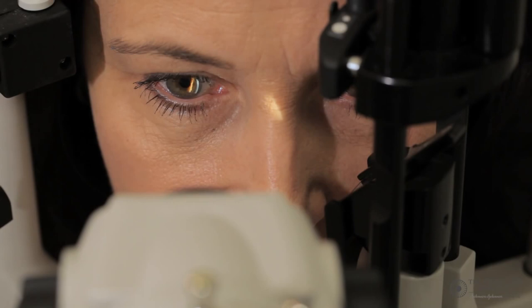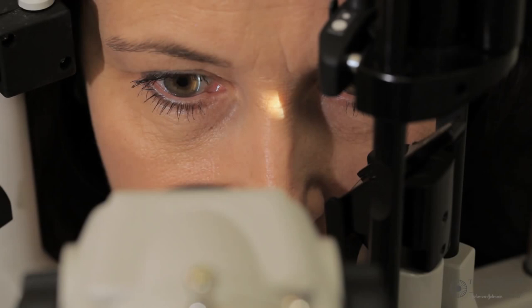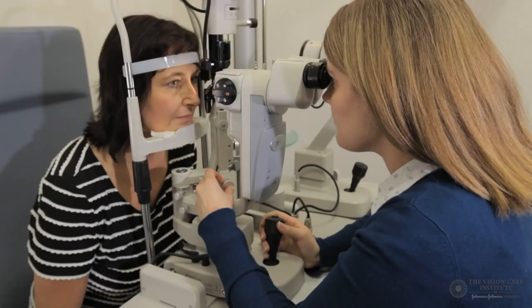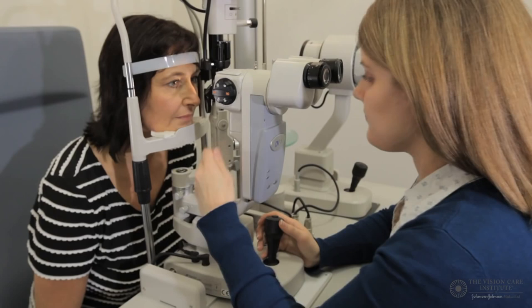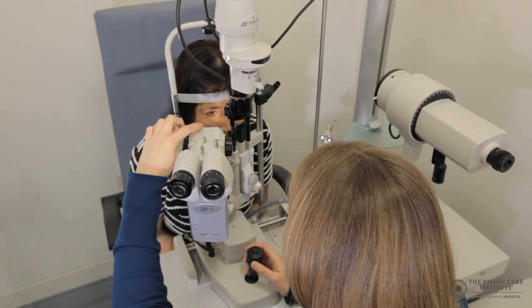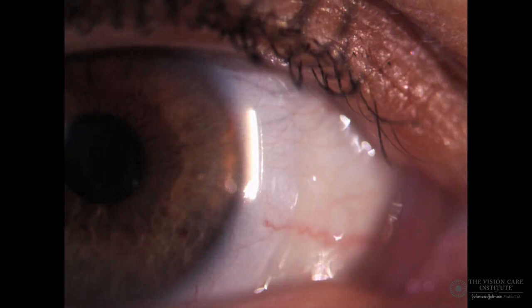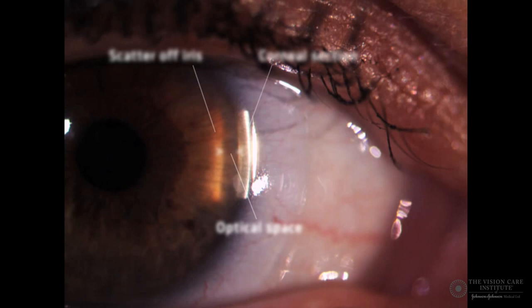In most patients, when we attempt to form a section at the very edge of the cornea, what typically happens is that the nose will get in the way of the illumination system, as shown here. As a result, the section cannot be formed while the patient is looking straight ahead at an angle of 60 degrees. In order to overcome this, we need to move the whole observation and illumination system together by about 5 or 10 degrees and ask the patient to direct their gaze directly into the microscope objective. When we do this, the section can be formed on the very nasal side of the limbus, as is being shown here. It is important that the eye's gaze is directed at the microscope objective.